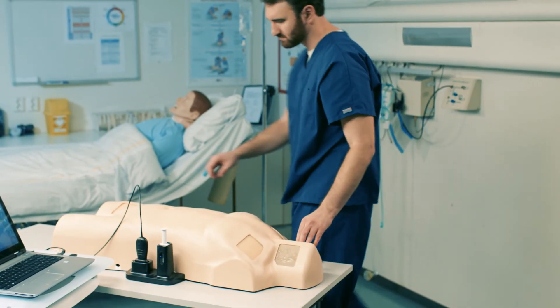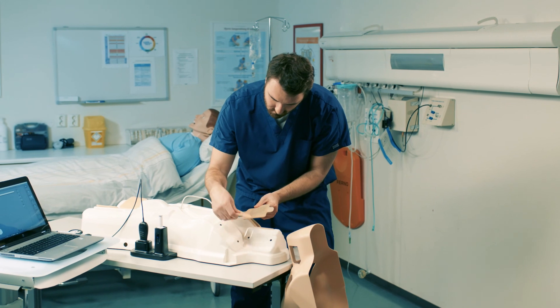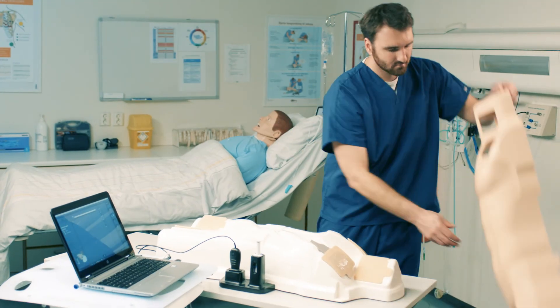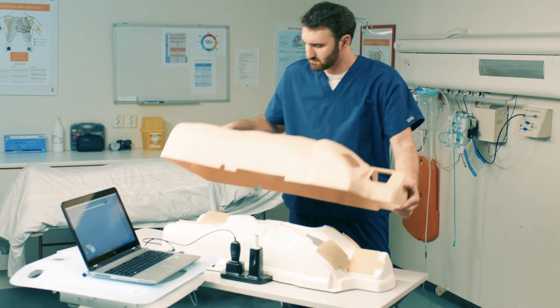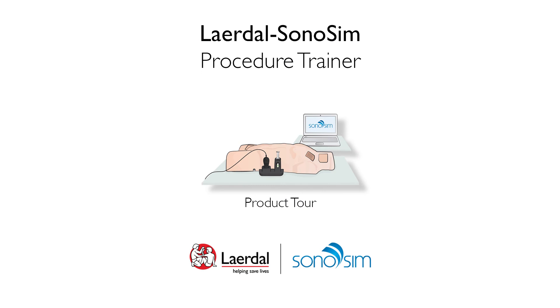If you choose to move to a different procedure location, remove the exoskeleton and reposition the trackpad. Position yourself and the computer accordingly and recalibrate. Thank you for choosing the Leradol Sonosim Procedure Trainer.